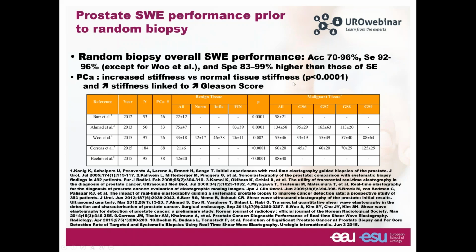And what is also interesting is that stiffness is correlated to the Gleason score, and stiffness is increasing with the Gleason score.